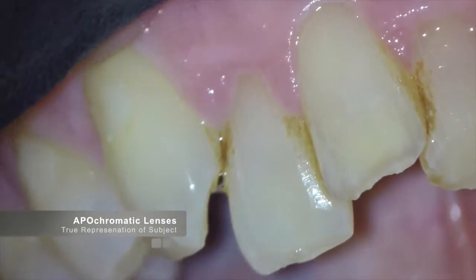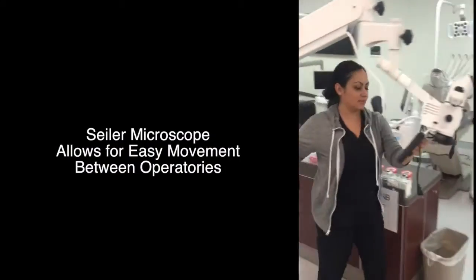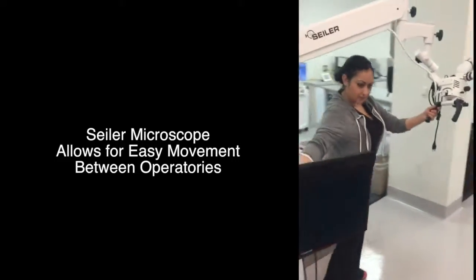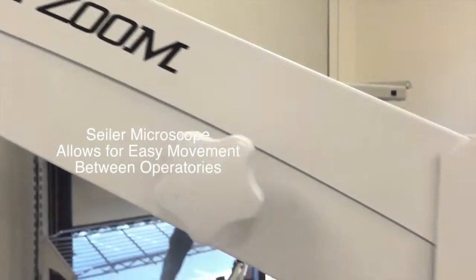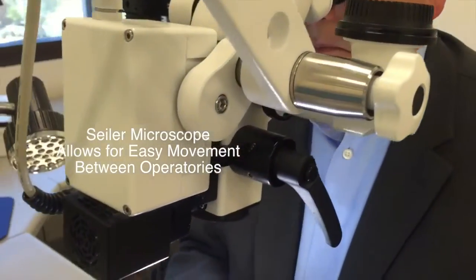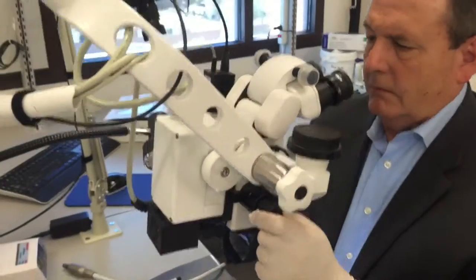Because the scope is available on wheels, in our center, we are able to easily move the scope from anywhere in our complex. This becomes necessary as we use the scope for demonstrations during workshops, and these workshops are held on the second floor, and this scope is also used for patient care, and our clinic is on the ground floor. The scope is used in many of the different workshops to demonstrate procedures, as well as during the course of normal and routine patient care.